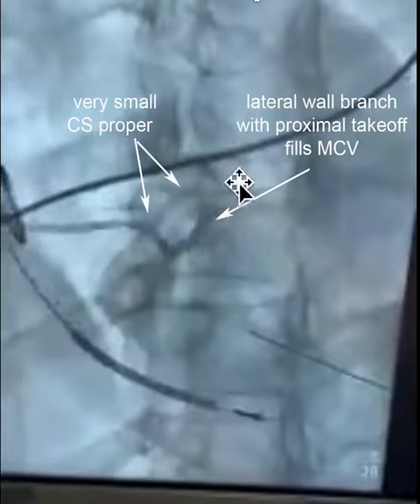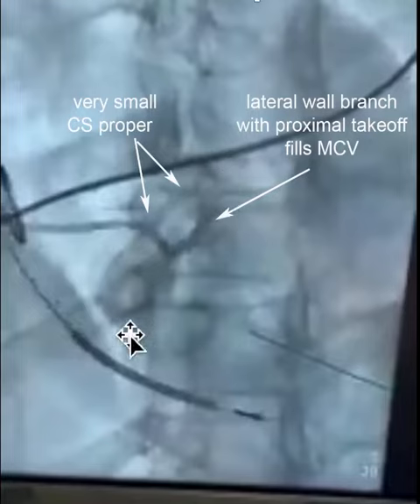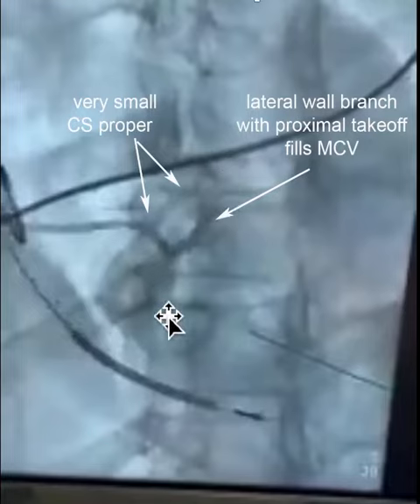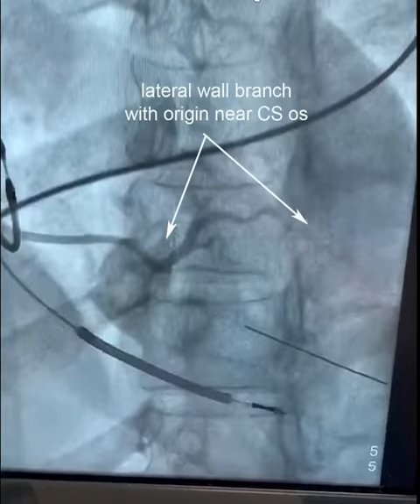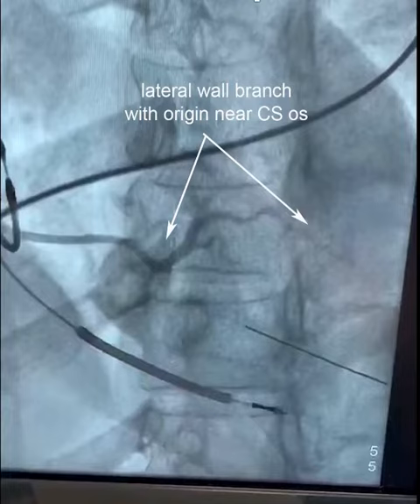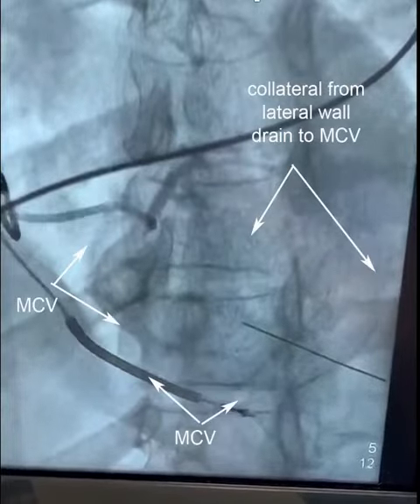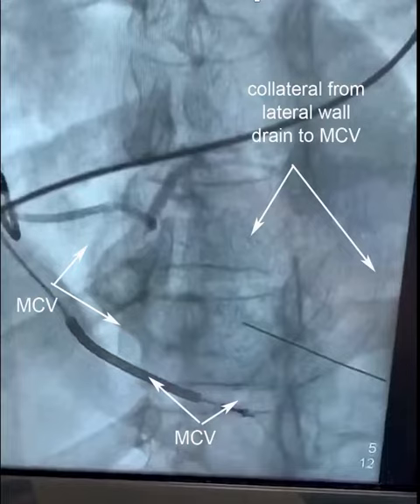And then here's the diminutive coronary sinus going up here. If you watch carefully, you'll see that the majority of the blood flow is actually returning from the lateral wall to the middle cardiac vein. So there's the middle cardiac vein there.